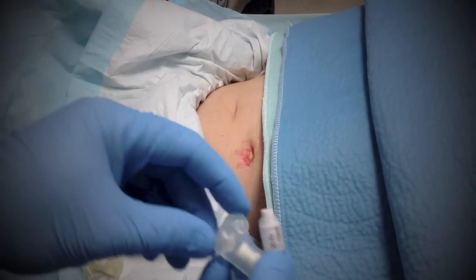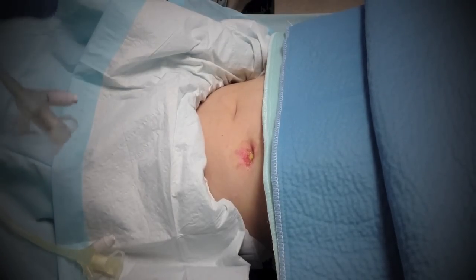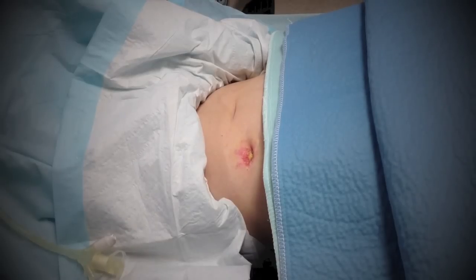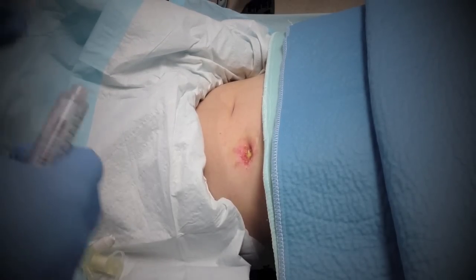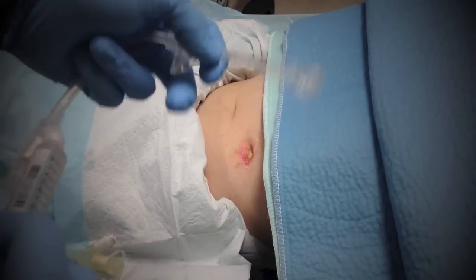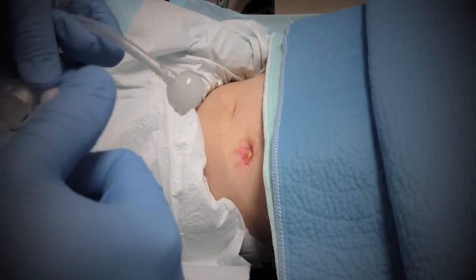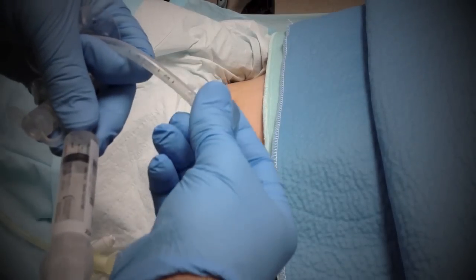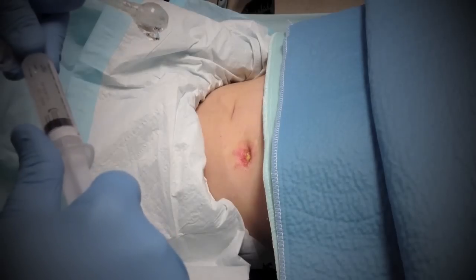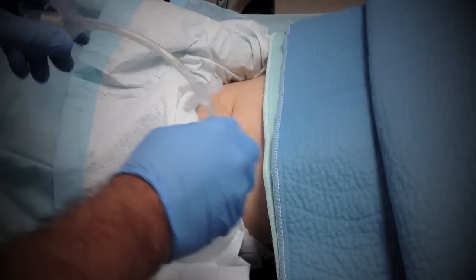This is where we go in to put the saline so the balloon inflates — kind of like a Foley catheter. You always want to test it to make sure there's no leakage before you go in. Put some saline in and make sure everything is mechanically correct. That's nice and hard — then we take all that saline out. That's the big water balloon that's going to be in there once we introduce it.